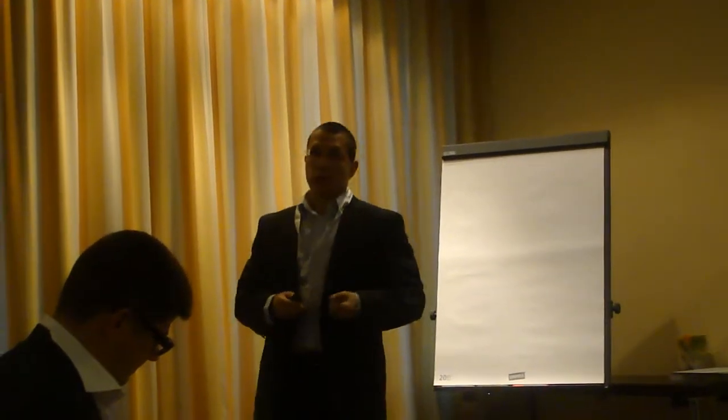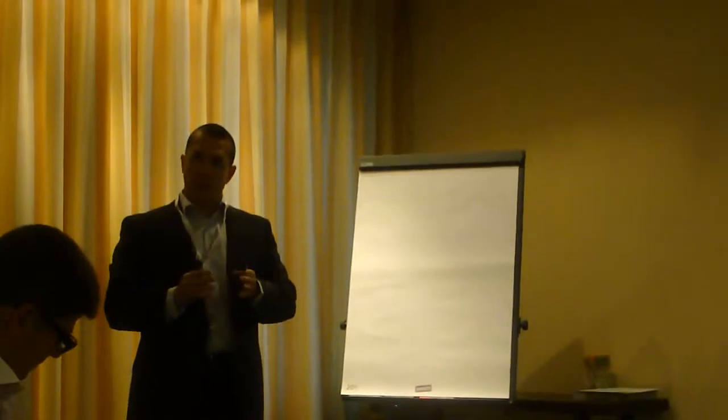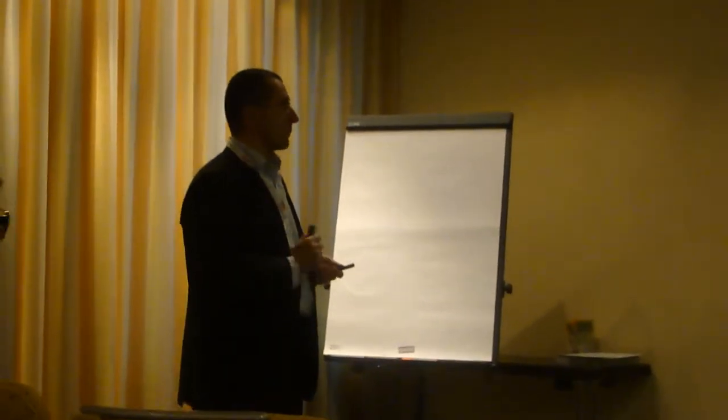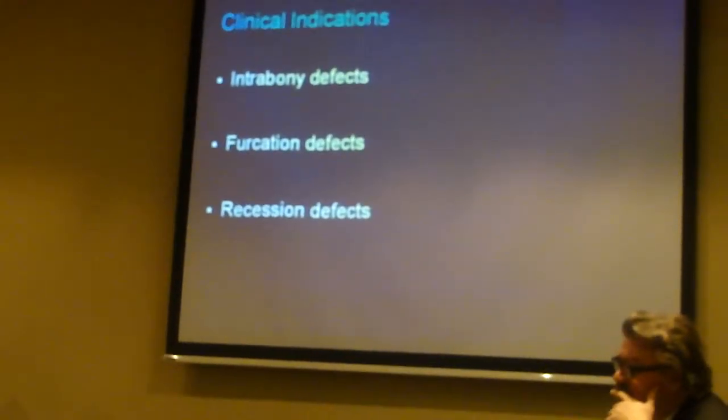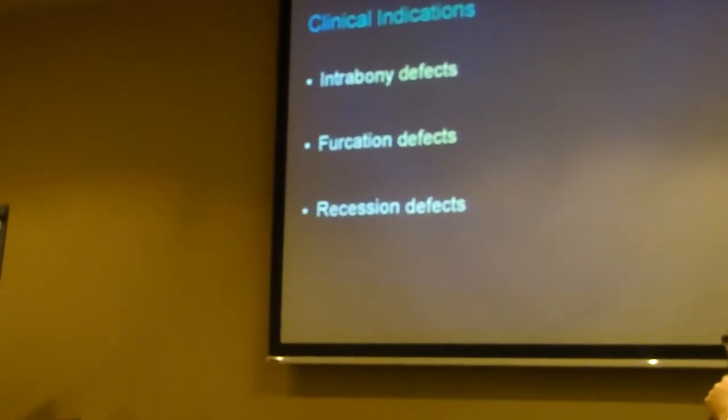Ladies and gentlemen, I would like to show you some clinical cases. We had a wonderful overview by Dr. Cochran, and I will focus only on potential applications in the daily practice. In fact, we have three main indications for the application of enamel matrix proteins, Emdogain.